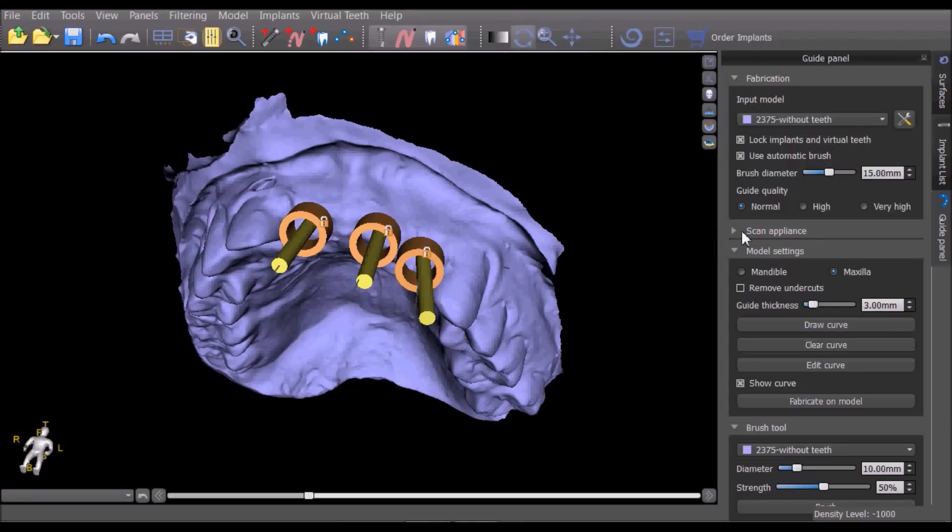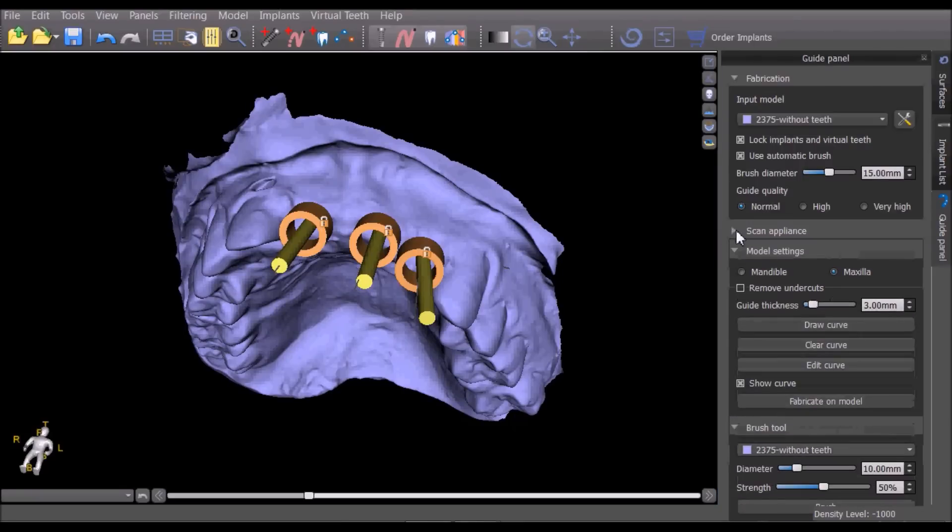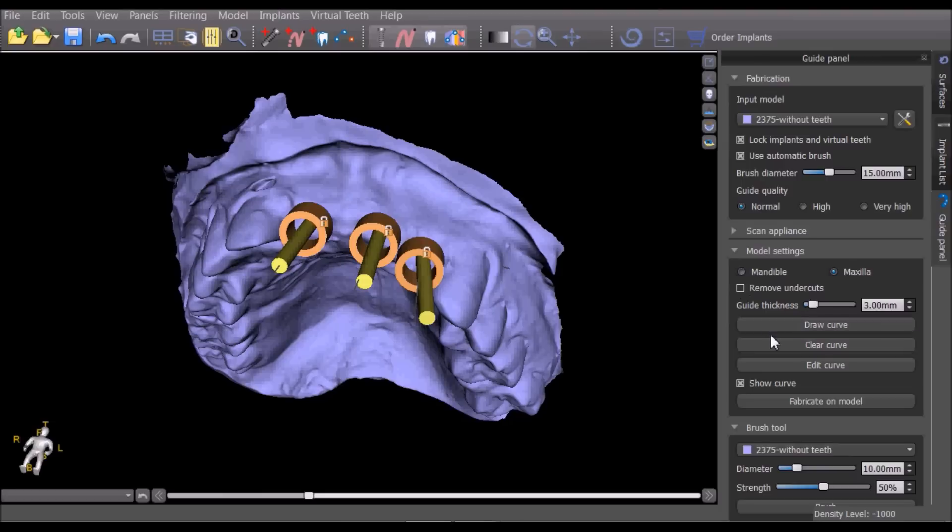The scan appliance section can be skipped when fabricating a guide based on a model. Click the relevant draw type, check remove undercuts if desired, and press draw curve to start drawing the curve on the model.